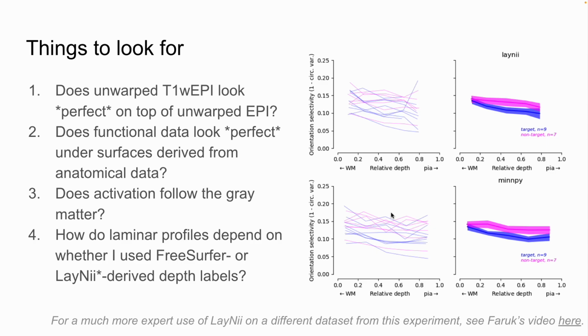Further consideration of this data set showed me that the process of fitting circular variance to the data is sensitive to noise, such that, by the quirks of how it fits and responds to noise, we will spontaneously get lower circular variance and higher OSI numbers when the data are noisier.